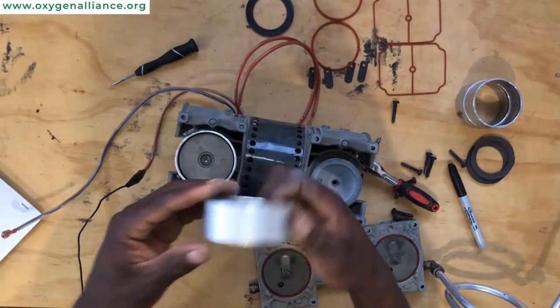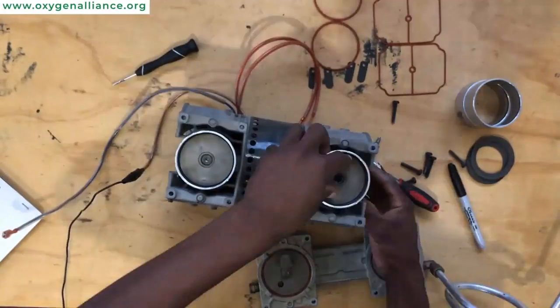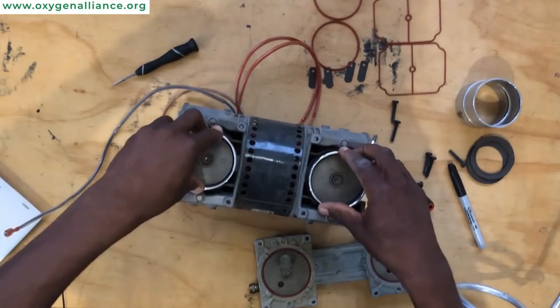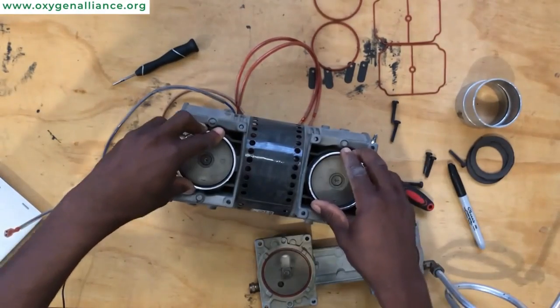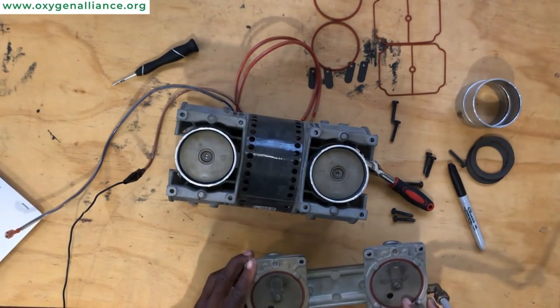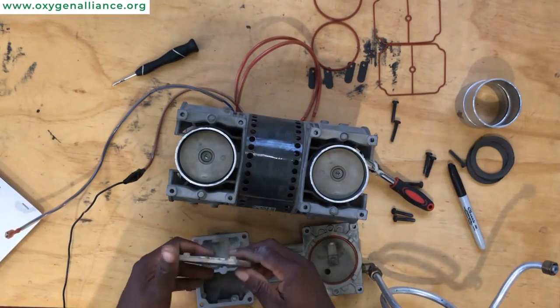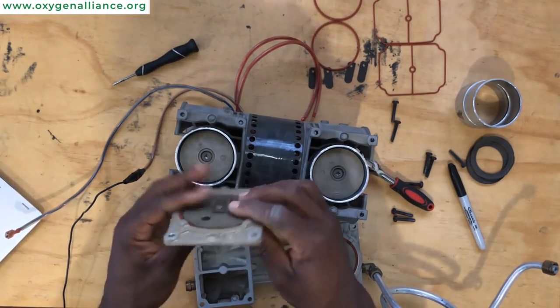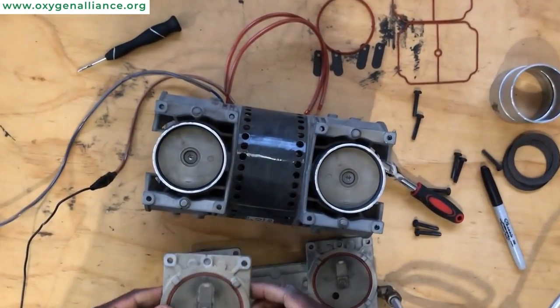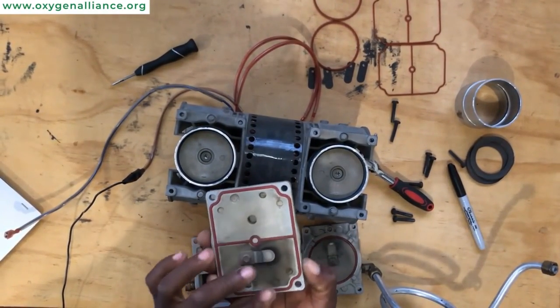Now we move on to the second cylinder sleeve. Now that we have finished replacing the cylinder sleeves, we can move on to changing the flapper valves. Normally you can sometimes see visible damage, but in this one we don't have too much damage. However, it's advised to change the flapper valves each time you service the compressor.